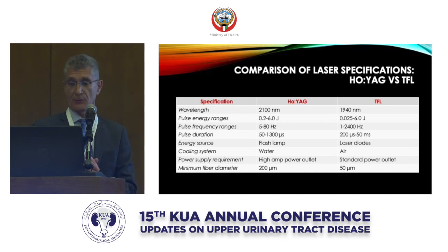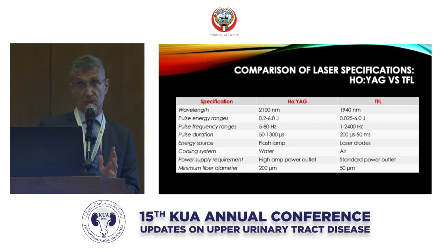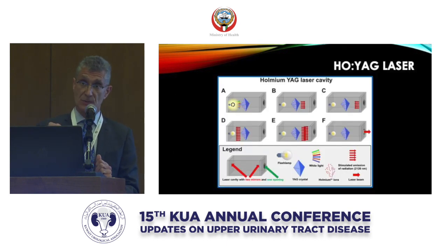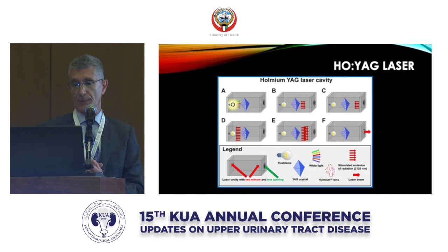In this initial work by Dr. Fried, he commented on a couple of things that are unique to this laser, particularly this wavelength, which is different from the holmium, and that it allows for some very unique properties. And those include the ability to ablate tissue or ablate a stone much quicker than we would see with holmium laser, 2 to 4 times faster than in his very initial in vitro work. And also noticed there's less retropulsion, and I think we've all experienced that, dealing with the stone in a hydronephrotic ureter with holmium laser, we're often chasing that stone up the ureter, and sometimes that's a bit problematic. So this was a very novel observation that perhaps this wavelength could eliminate that retropulsion.